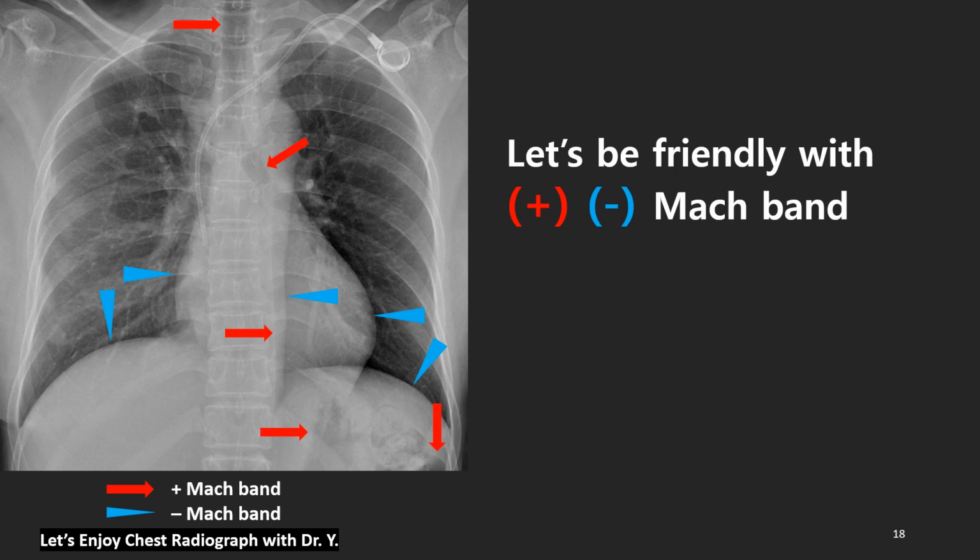Now we are closing. How do you feel about the Mach band theory in chest radiographs? Isn't it interesting? Fancy? Yes. Let's be friendly with positive and negative Mach band. Now you can all understand the positive and negative Mach band here.